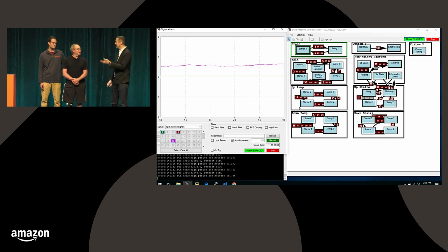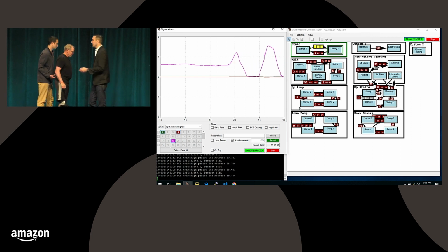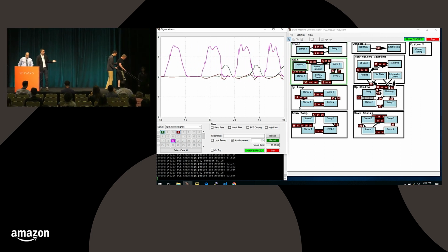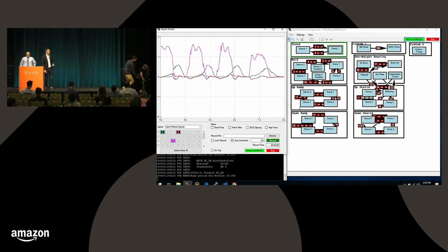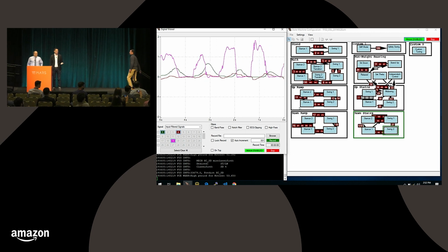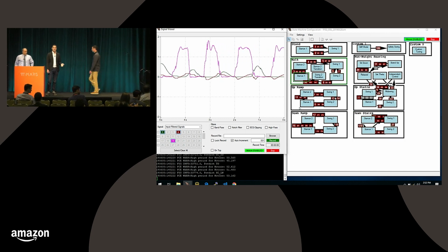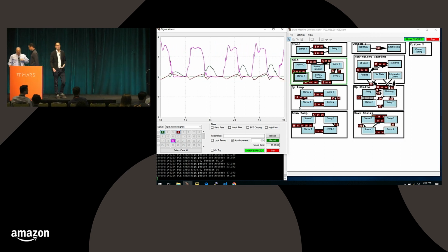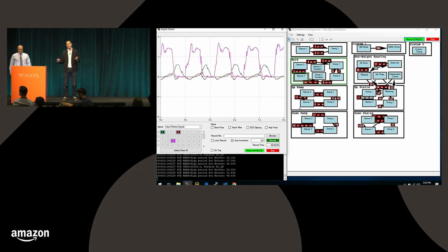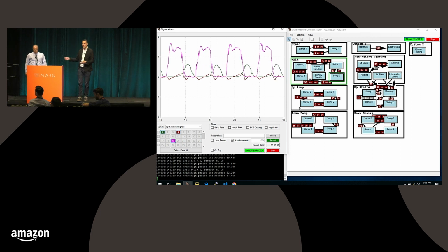Great, so now Terry's going to exit the stage, walk around, and we'll talk you through some of the data that's being shown on the screen. It's going to transition automatically to stair ascent and transition back to level ground walking. If you look on the left, you'll see data streaming from the device. It's being telemetered from the onboard embedded system to the laptop, which is showing the data.